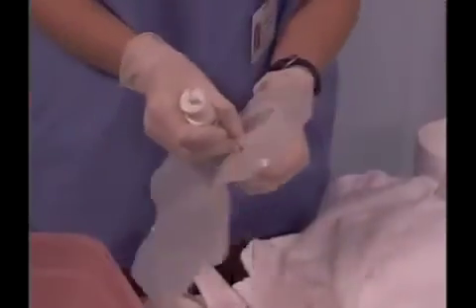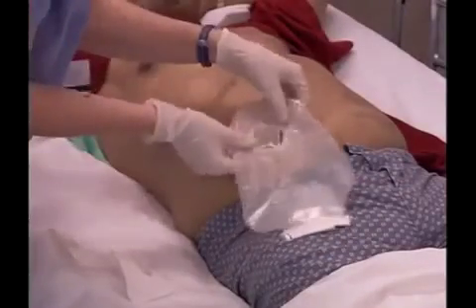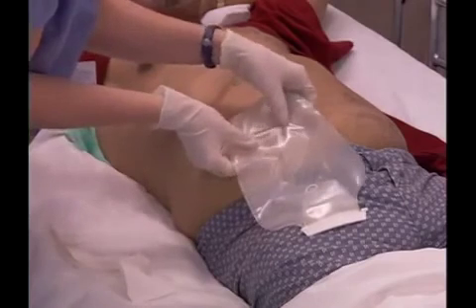If you are planning to add deodorant, place it in the ostomy appliance at this time. Attach the pouch to the appliance, making sure that the drain is pointed downward.